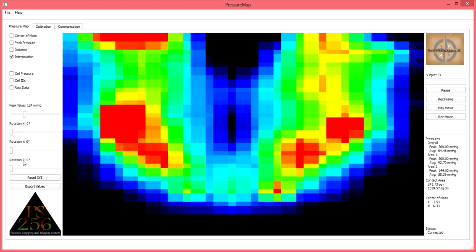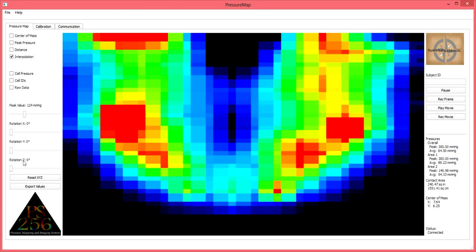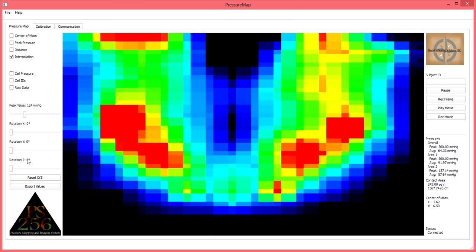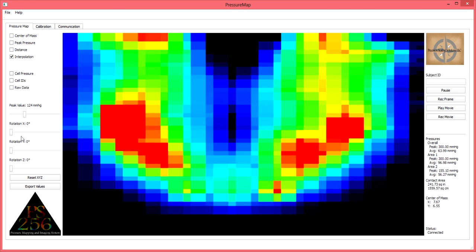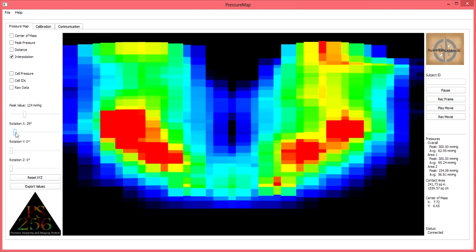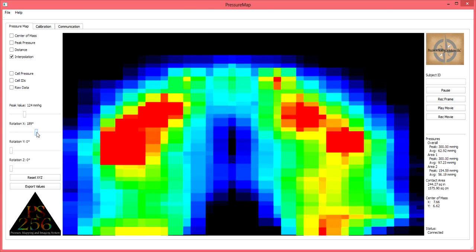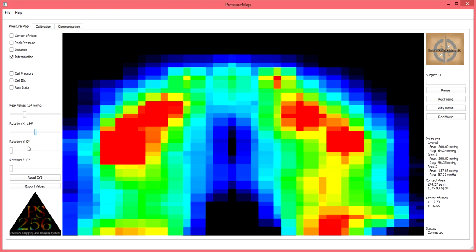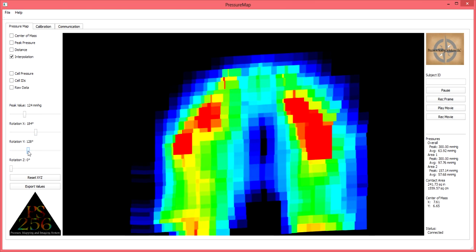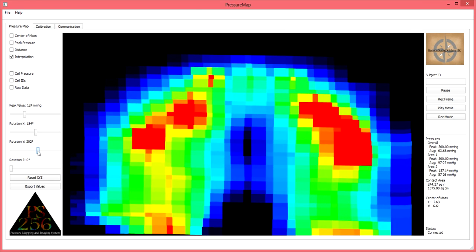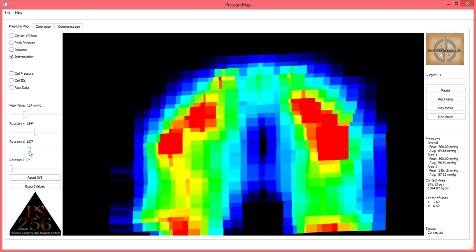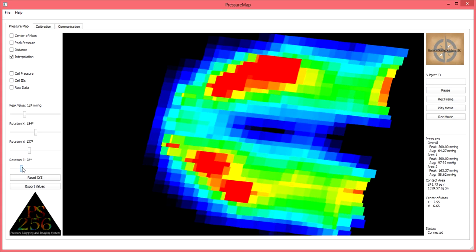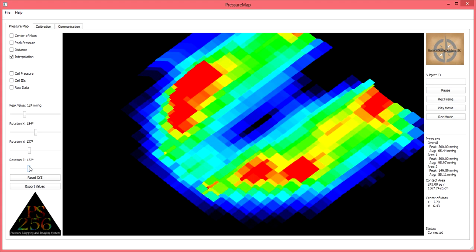Below the peak value scale are three additional slider bars, which are used to rotate the image. This is often needed to place the image in a perspective which is relative to the client sitting upon it. Or in some cases of clinical application, when incorporating the PS256 into billable treatment, this feature is often necessary to provide the user with an image appropriate in relation to how the client is sitting. Often times this is also helpful to create an appropriate image for letters of medical necessity.